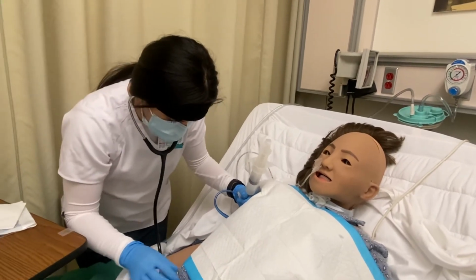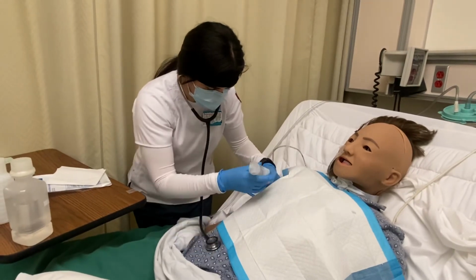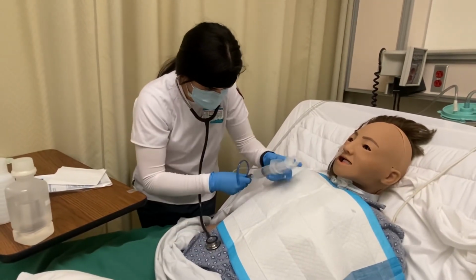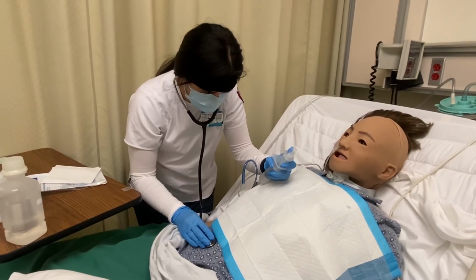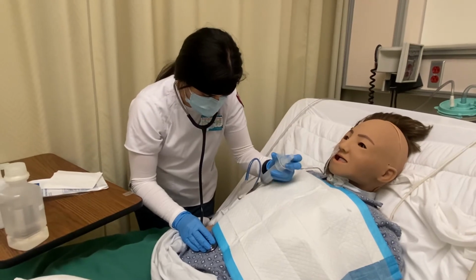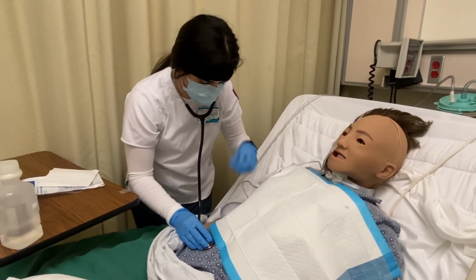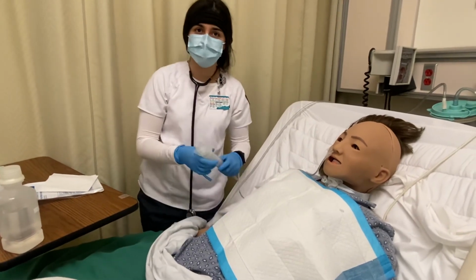Put it on the stomach, and I will push it. So I would make sure that I hear that whooshing sound.